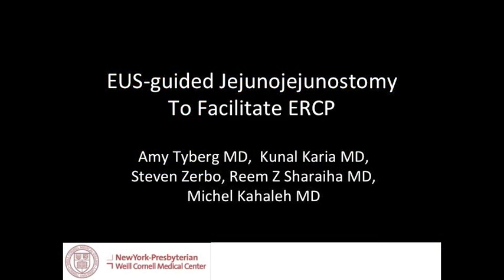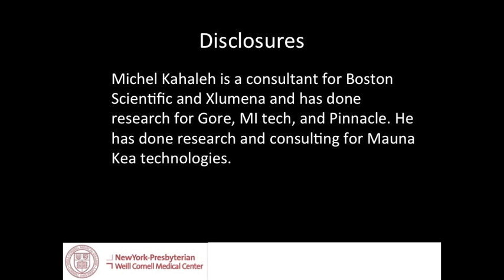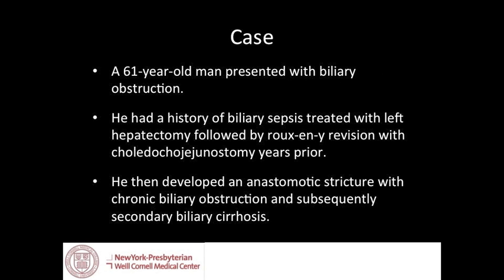EUS-guided Jejunojejunostomy to facilitate ERCP. A 61-year-old male presented with biliary obstruction.